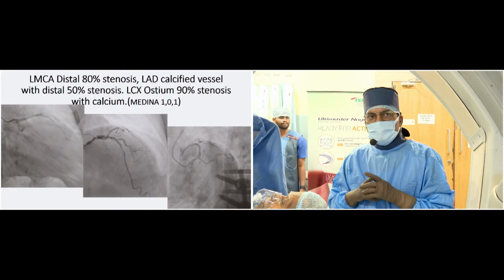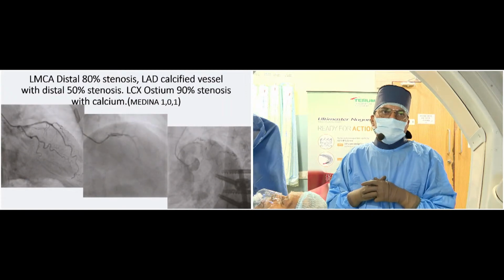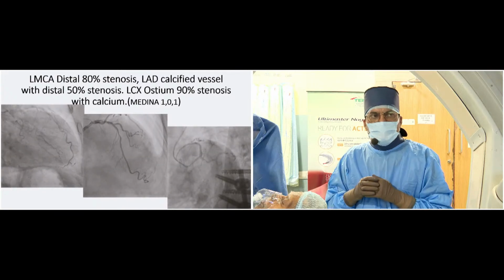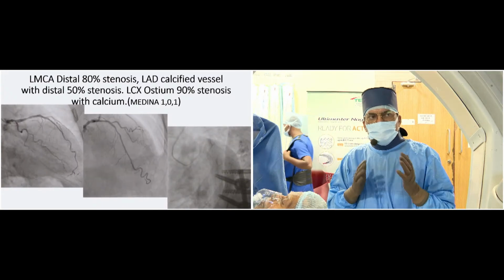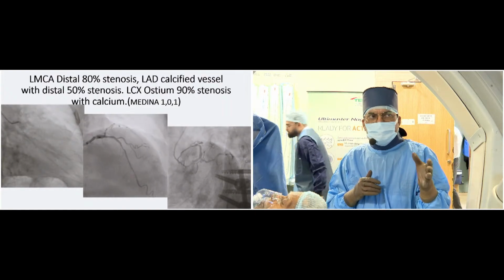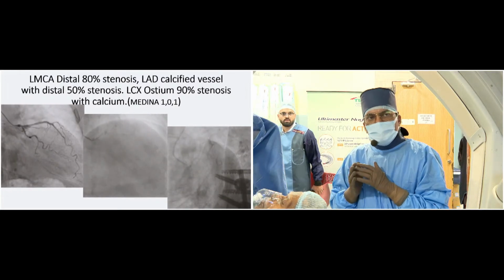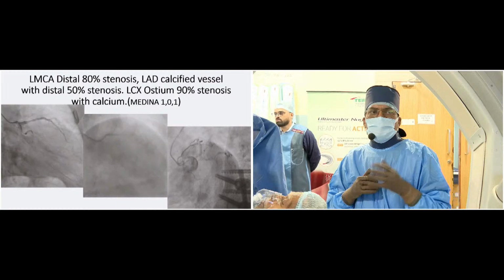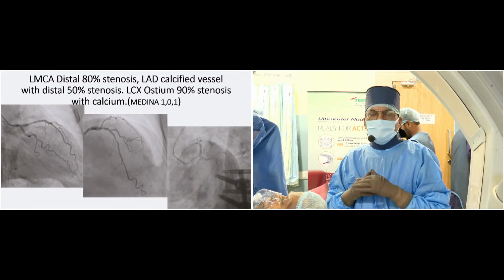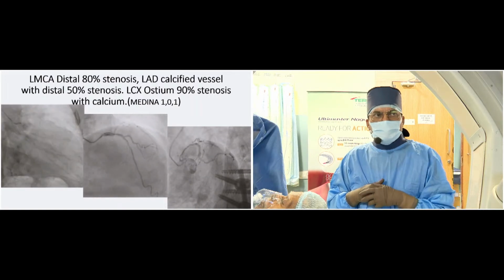And another thing is the wide range of stent lengths and sizes. Suppose you have taken a 3.5 stent, and for a left main to LAD, if you are doing the distal 3.5, you can upsize the left main up to 5.5 or 6. Distally you can maintain it with a 3.5. So even such a mismatch can be tackled very effectively with this new technology.